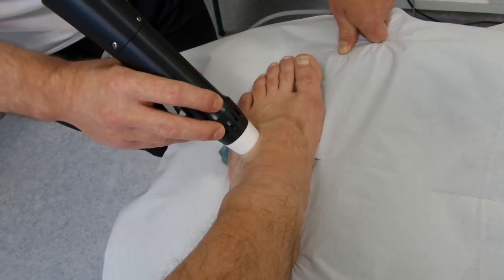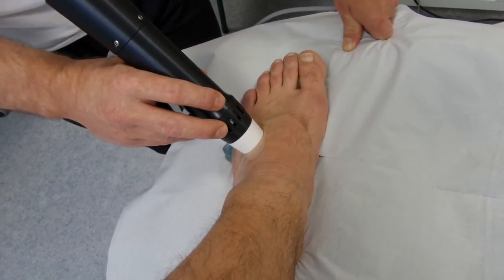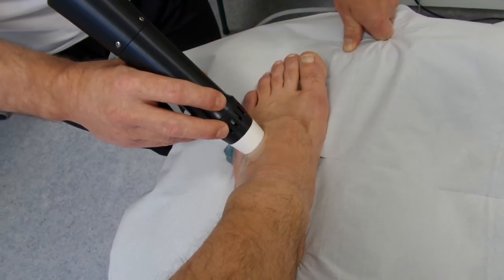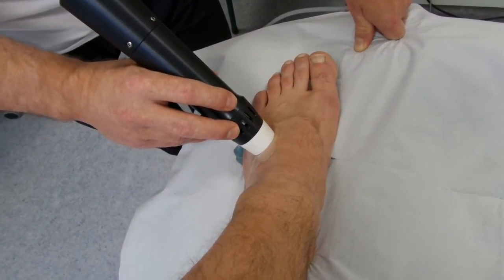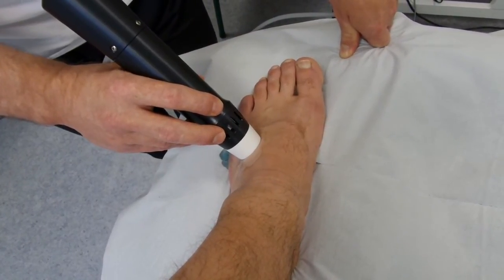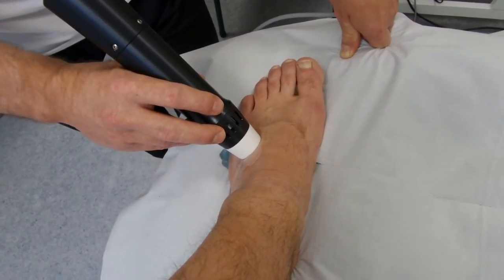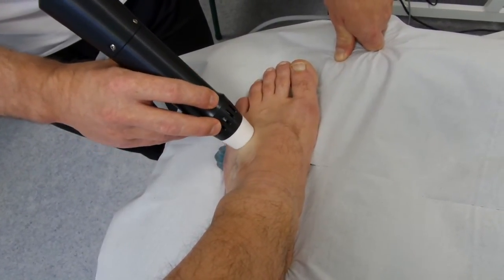In the past, people have tried to burst the bursas and have injected them. That hasn't been effective in this case. We've also tried laser therapy to reduce the bursa, and that hasn't been particularly effective. We've also tried podiatry and orthotics, and so far that hasn't got rid of the problem.